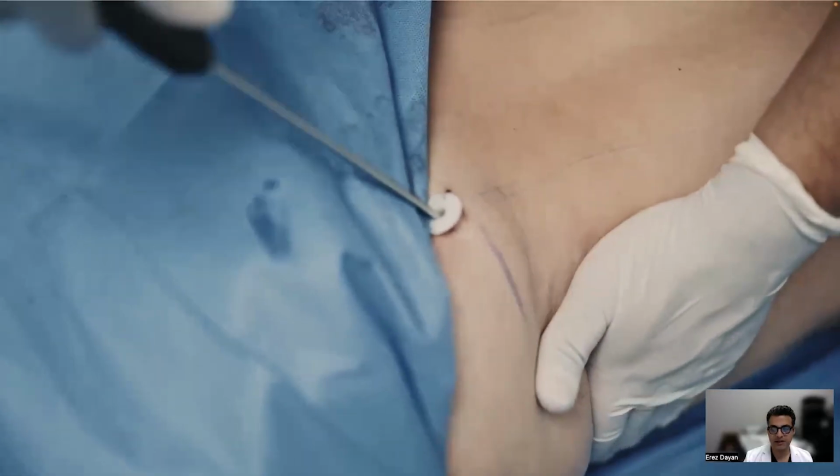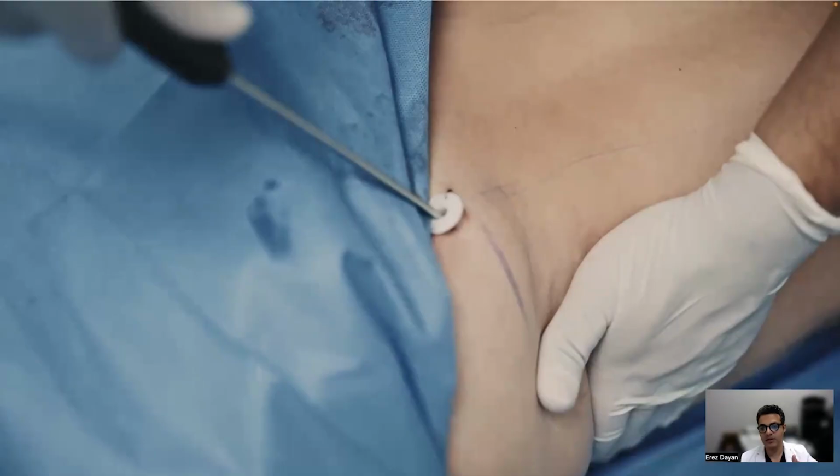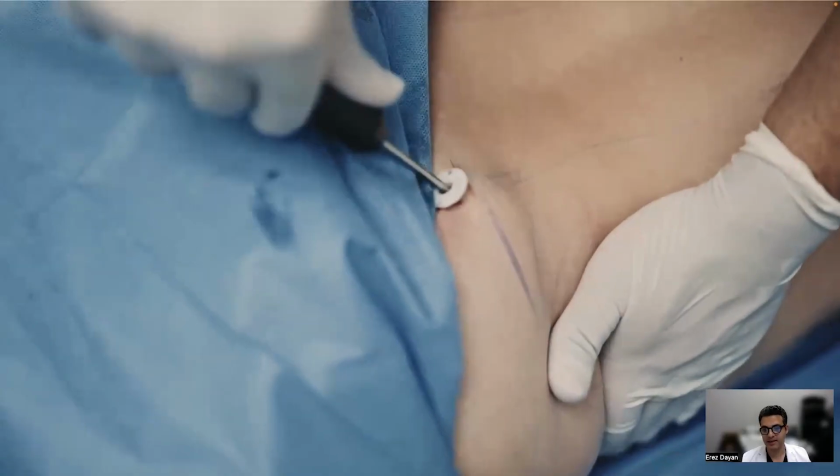Now here, I'm using a flat technique. So my hand is flat on the skin. I can feel where the cannula is underneath. I can feel my skin thickness. And I'm bringing the fat actually closer to the cannula by pushing it in.